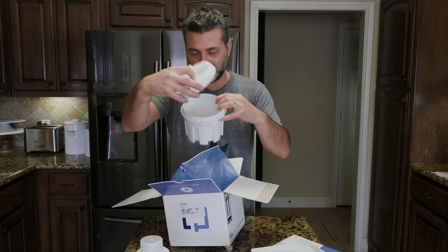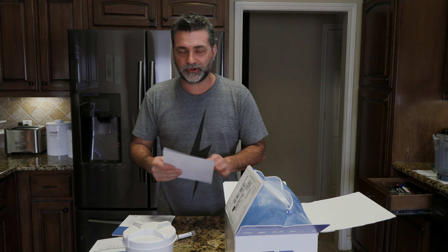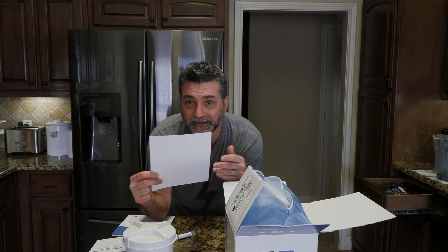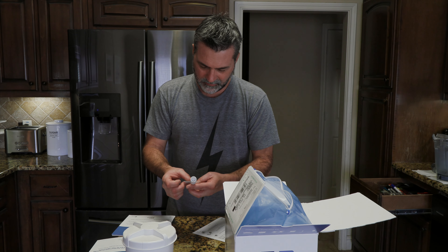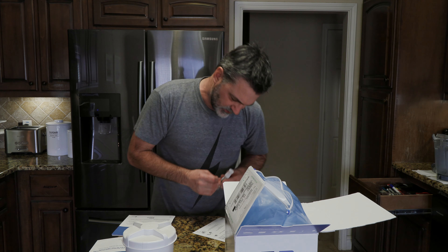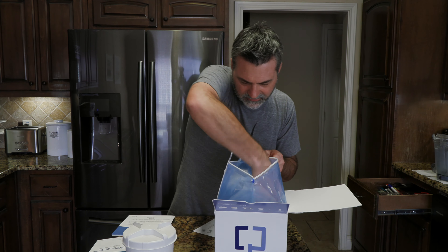Now we just wait to do what I need to do before I ship this off this afternoon. Once you're done doing what you've got to do, there are some labels here — you have to put your name, birthday, and the date of collection and time. So you peel those off, wrap it around, and put it on this thing. This goes back in the box. Do the same for this one — put it on there and put it back in the box.